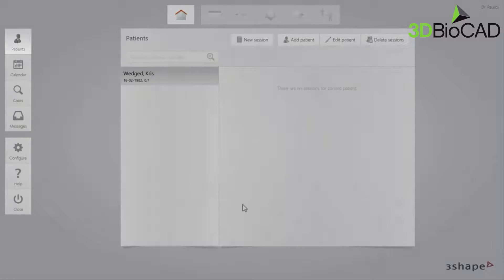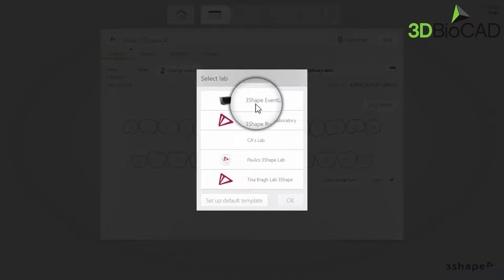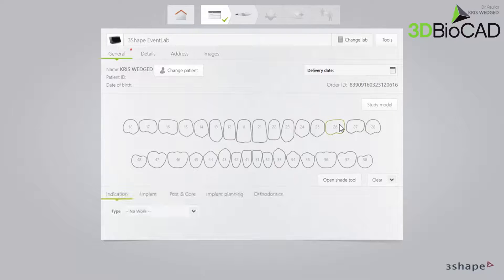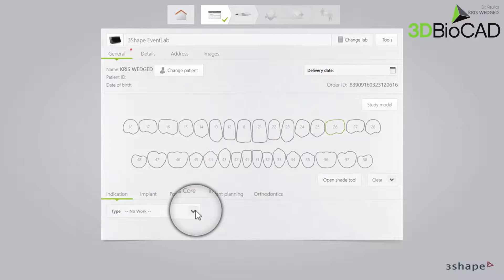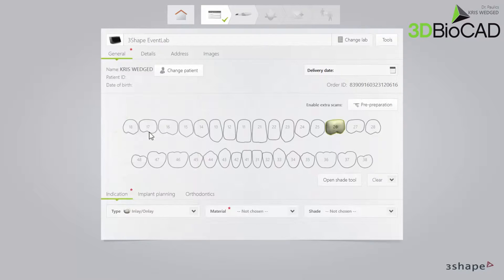On the Patients page, click New Session. Select the lab you want to produce the case. On the order form, select the tooth on which the restoration is planned. Select the tab Indication and open the drop-down list named Type and select Inlay Onlay.